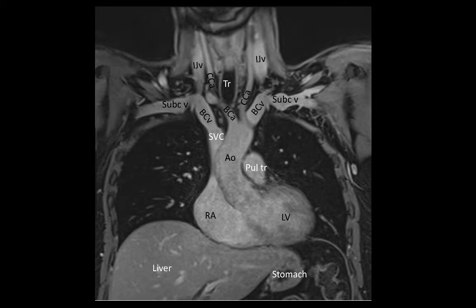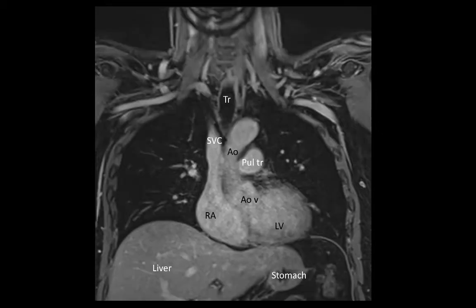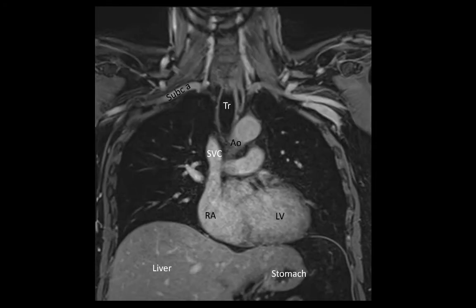Looking again at the heart, we can see the aortic semilunar valve. The right subclavian artery, which had occupied a position posterior to the subclavian vein, is now in view. Now we see the left subclavian artery. The branching of the pulmonary trunk into left and right pulmonary arteries is now also evident, and just lateral to the superior vena cava we can see the right pulmonary vein.